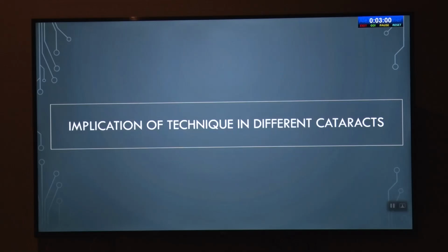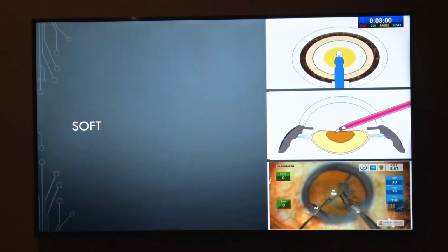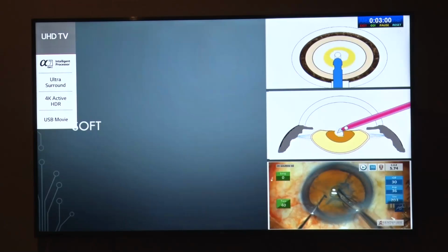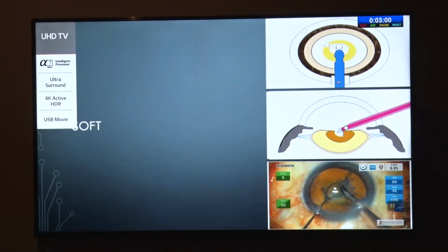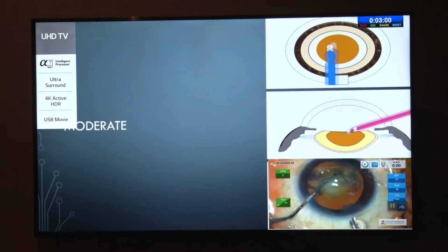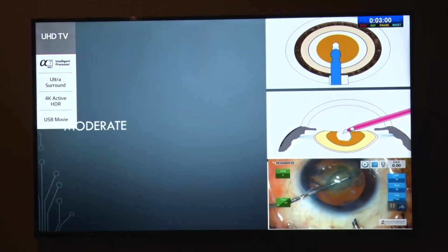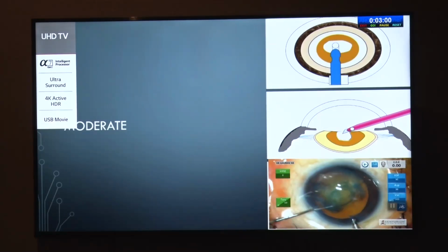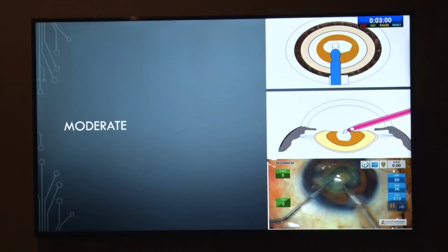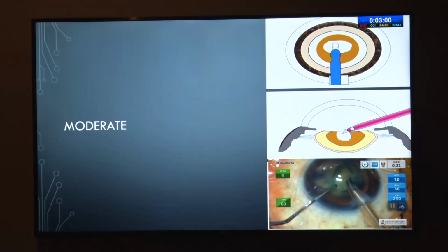So here I will be showcasing the different types of cataracts. First is the softer cataract, in which you can see that a crater has been made and you have enough space to do the things without going into the periphery. Now the moderate type of cataract comes. It seems to be not a very soft cataract, but a slightly harder cataract. The same principle is to be followed, but slightly increase the size of the central margin. And then debulk. You are always away from the posterior capsule.